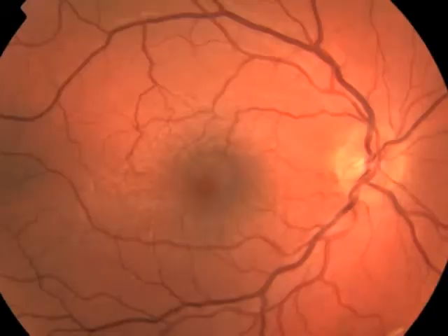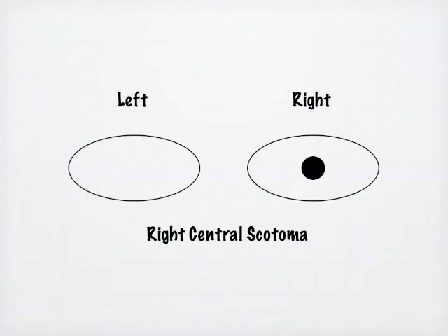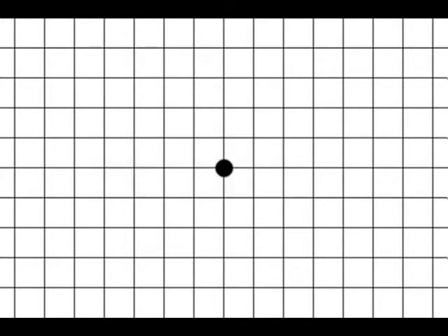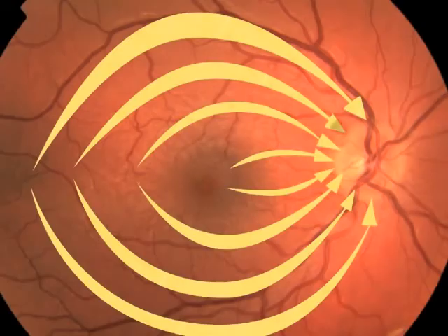Damage to the macular area of retina causes loss of central vision or central scotoma, seen most commonly in age-related macular degeneration or AMD. An Amsler grid is a simple 5mm grid pattern where the patient attempts to fix at the central dot from about 30 cm with each eye in turn. These can be useful to identify and monitor central scotoma. A new or changing central scotoma, or indeed distortion of central vision, may indicate treatable wet AMD, and should be seen promptly by an eye specialist.